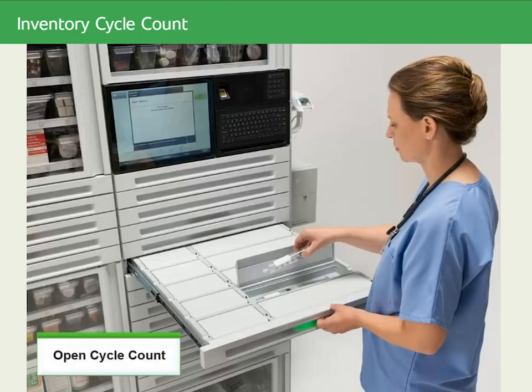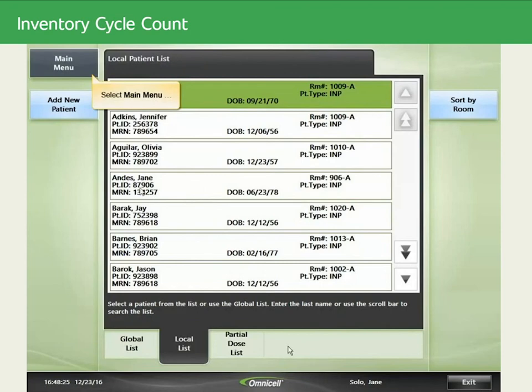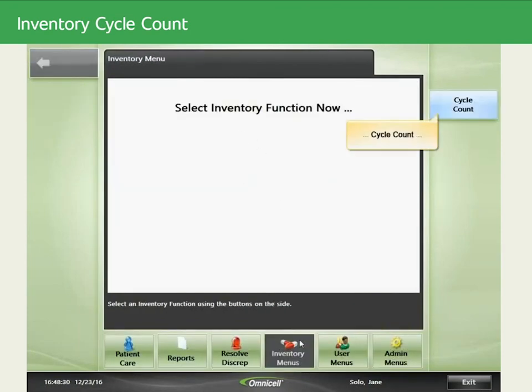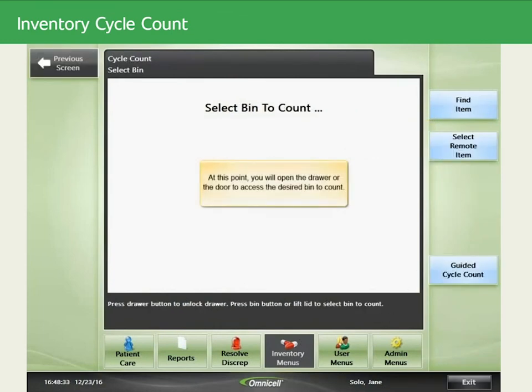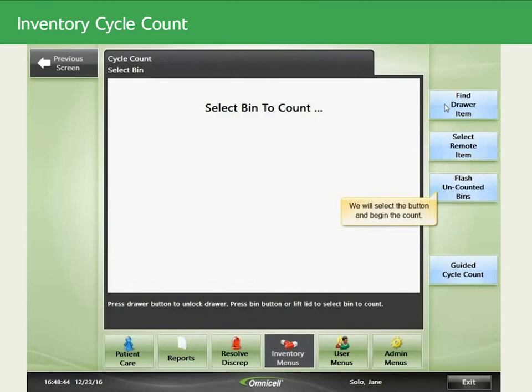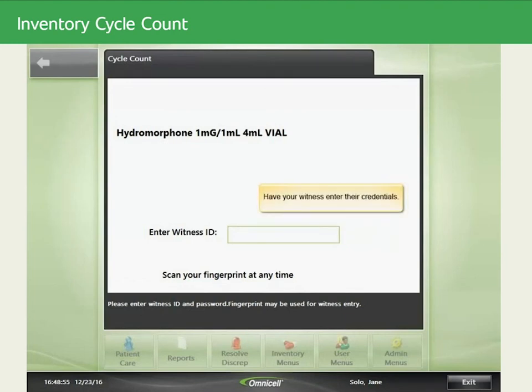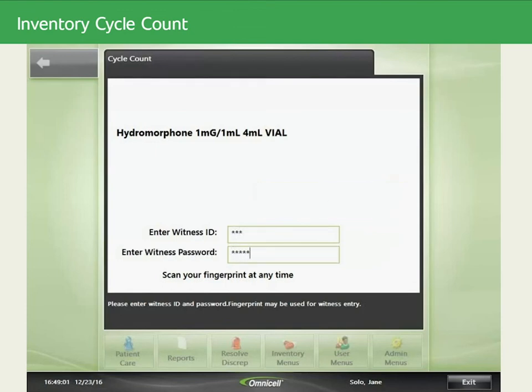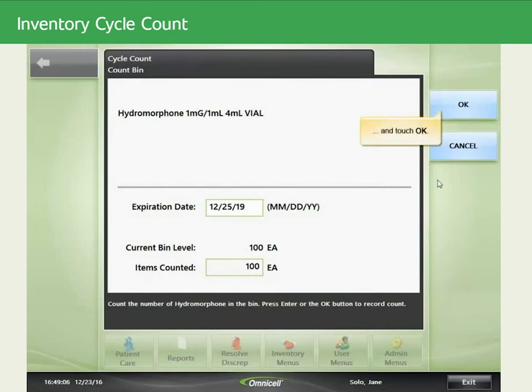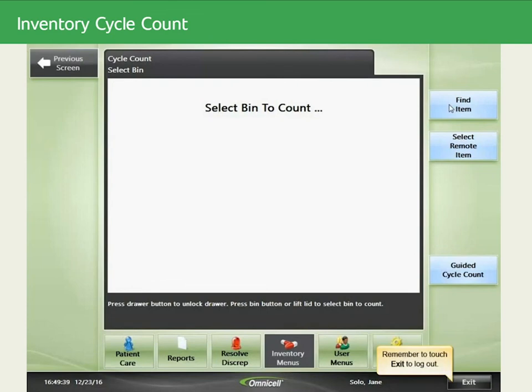For an open cycle count, follow the same process to access the cycle count screen. Log on to the cabinet, select Main Menu, Inventory Menus, Cycle Count. Then open the drawer or door to access the desired bin. Upon opening the drawer or door, the Flash Uncounted Bins button appears. Select the button and begin the count. When counting narcotics, you may need a witness — have your witness enter their credentials. Enter the count and touch OK. Continue counting all items until complete. When done, remember to touch Exit to log out.